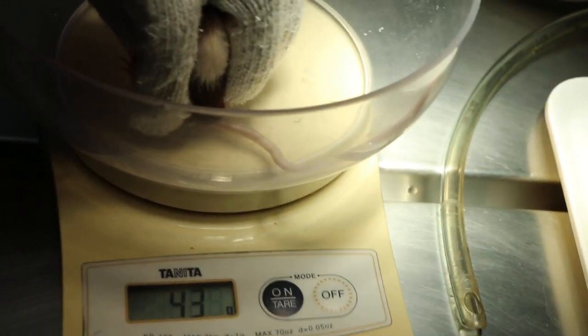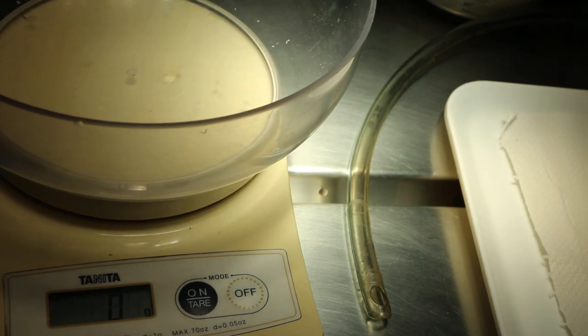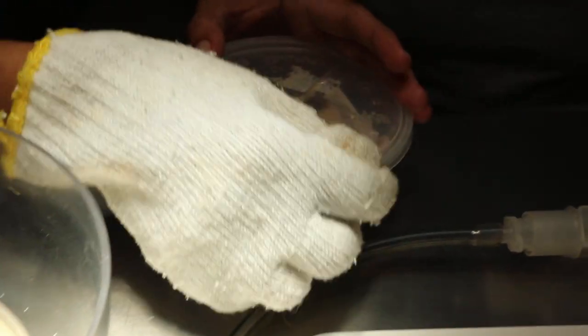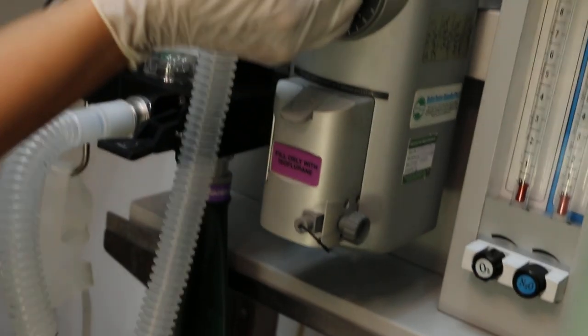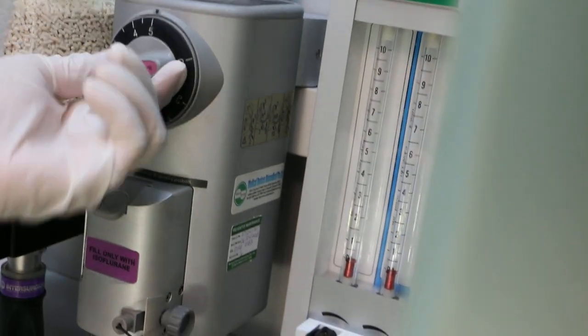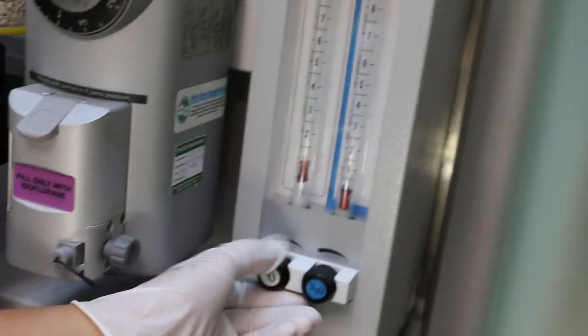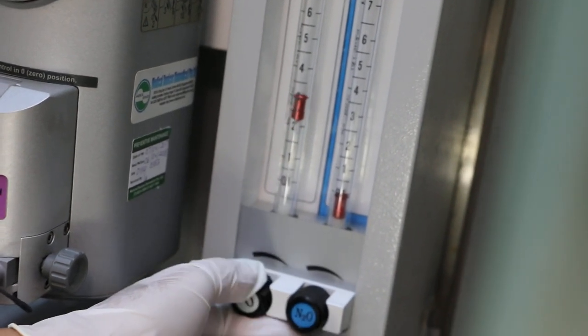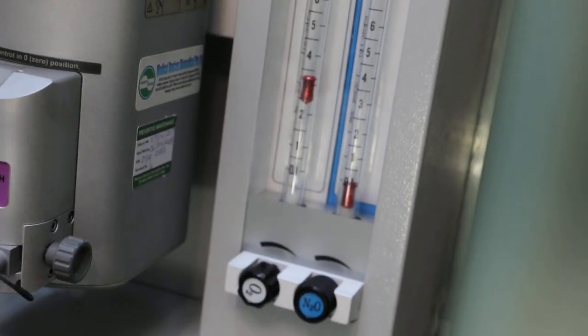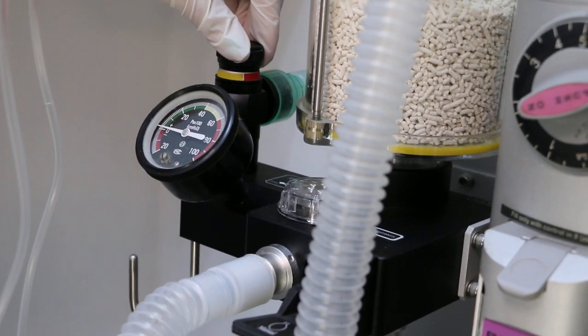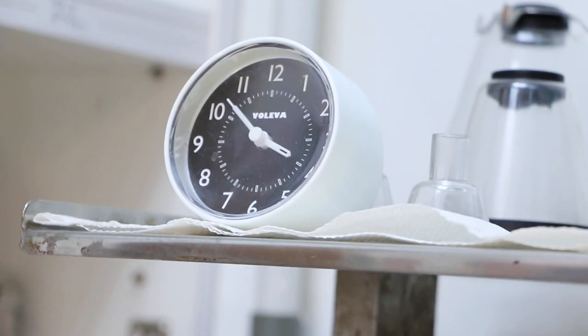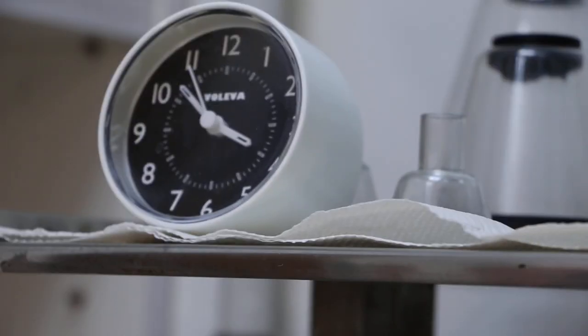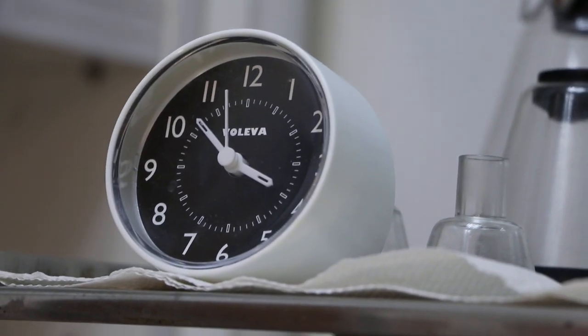Now we go into anesthetic. The safest anesthesia is gas. Isoflurane at 5%, press in at 5% and run at 3 liters per minute at a closed circuit or semi-half open. The red one is closed, yellow one is half open. Now we see the time also and we record down the time of anesthesia.